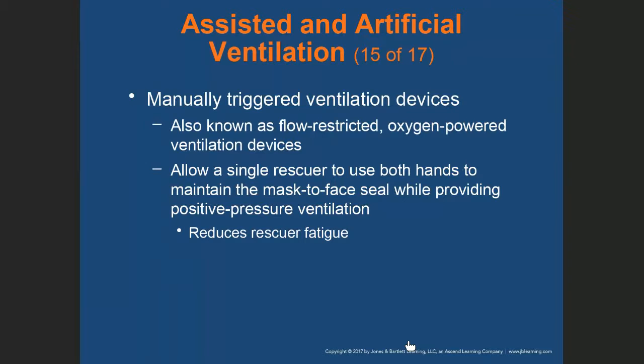And basically, it's a device in which you put a setting based on the patient's body weight and their appropriate volume for respiration. And once you put in the setting, you watch the patient and there's a button that you press on the device that will deliver a ventilation based on the settings that were entered in the device.